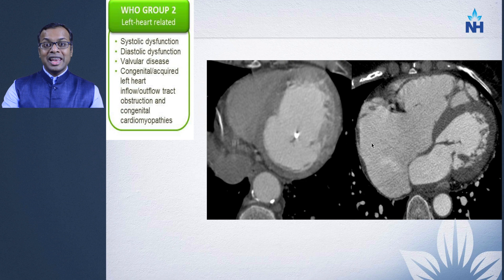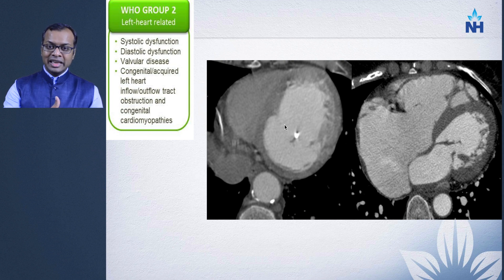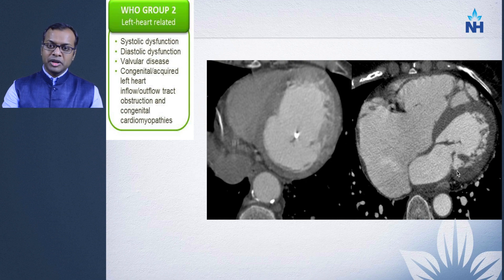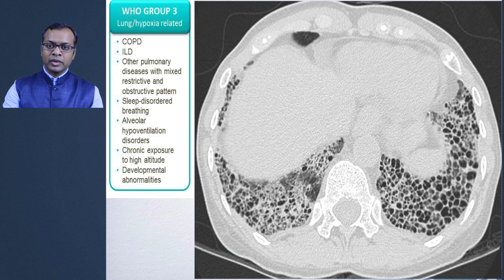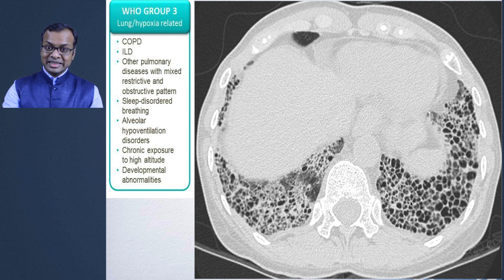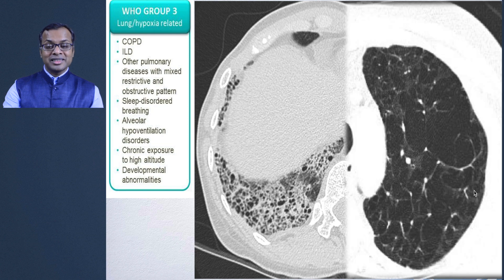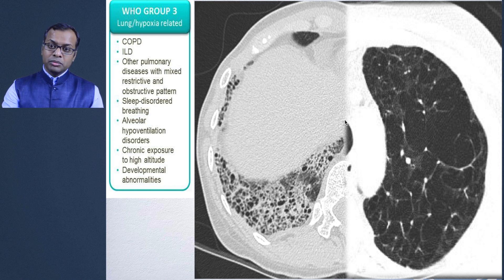Group 2 is about left heart dysfunction. A patient with dilated cardiomyopathy and diastolic dysfunction leads to back pressure into the LA and pulmonary veins, causing pulmonary hypertension. Another example is thickening of mitral valve leaflets consistent with mitral stenosis. Group 3 pathologies include interstitial lung disease with extensive honeycombing and fibrosis, or severe emphysema — all causing hypoxia and leading to pulmonary hypertension.